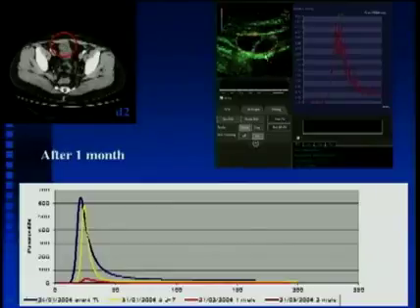And a very important point for this patient, when we performed the PET CT, it was normalized. And why? Because remember, the resolution of the PET CT is about 3 millimeters. And this technique is not able to detect these vascularized walls in the tumor, probably measuring 3 millimeters. So finally, the ultrasound is more sensitive than the PET, and this is a quantification curve.